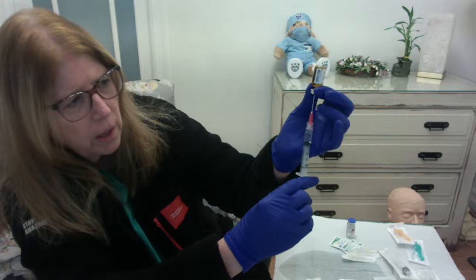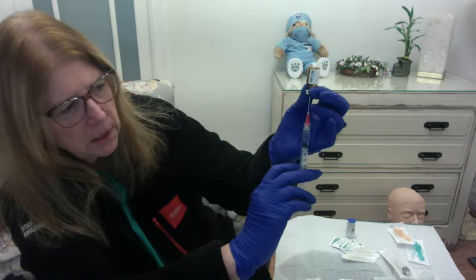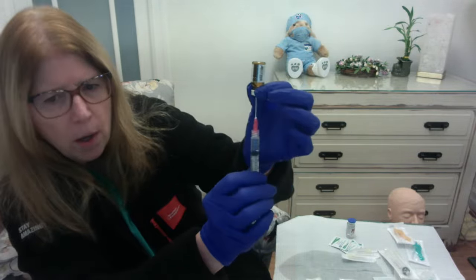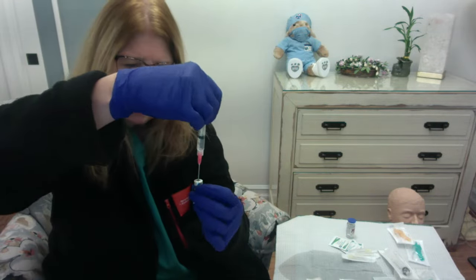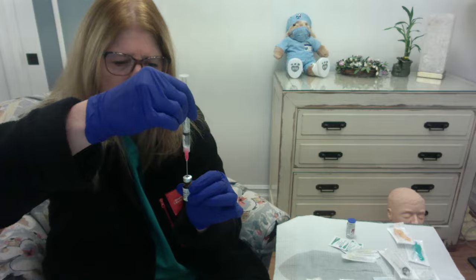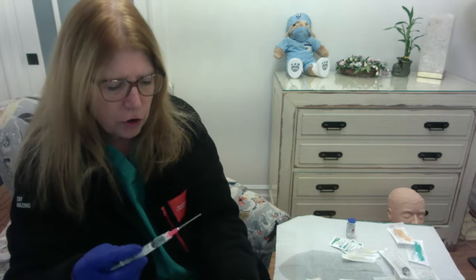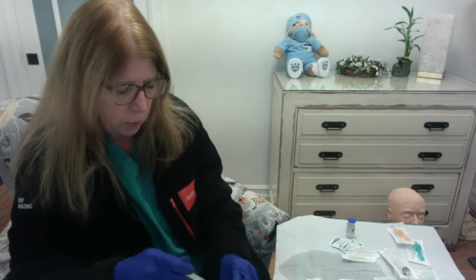So I'm going to go ahead and continue to pull back. I'm going to go a little past the 1 milliliter, and then I'm going to push this back up to my 1 milliliter marking. I'm going to invert it again back to its normal position and take out my needle, okay?